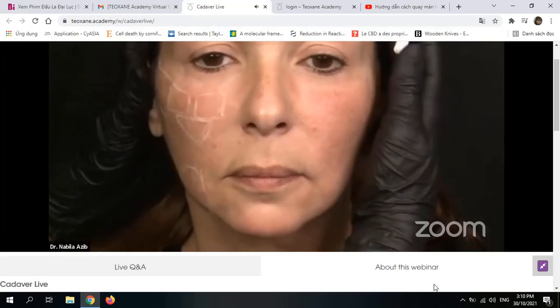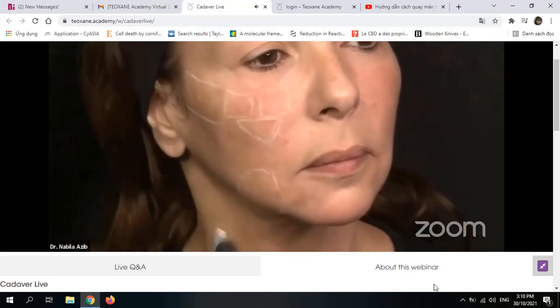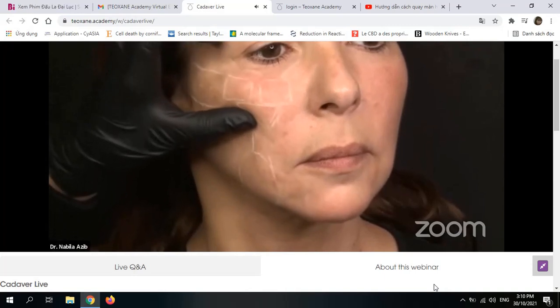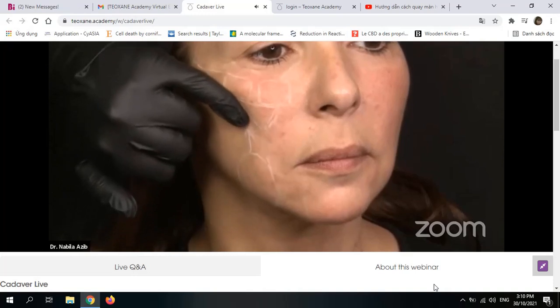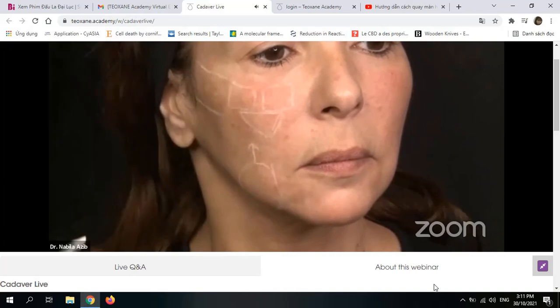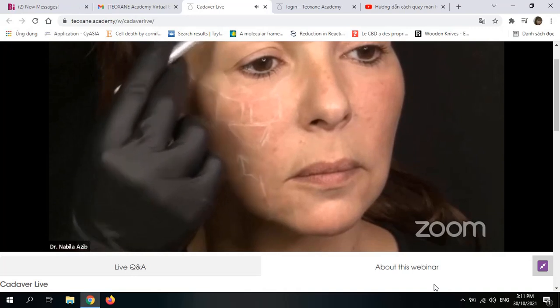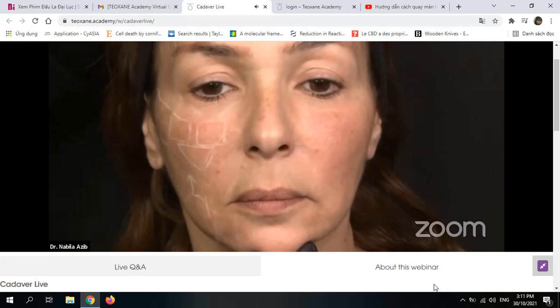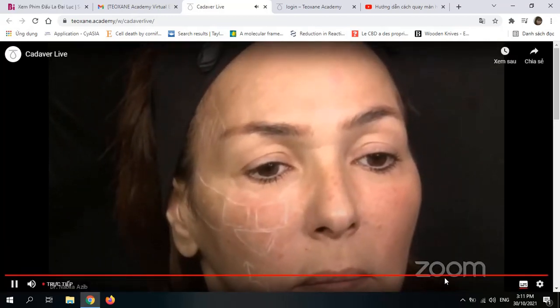And this mid-face projection will also help me to have a vertical vector to the jaw, because I want to have a lifting effect, not by inflating too much, but just by lifting this jaw a little bit vertically. So that would be my first vector. Of course, with injecting on the mid-face, I will need to harmonize with the temple, otherwise the temple will look much more hollowed. And here I will be using the gunshot technique with RHA4.